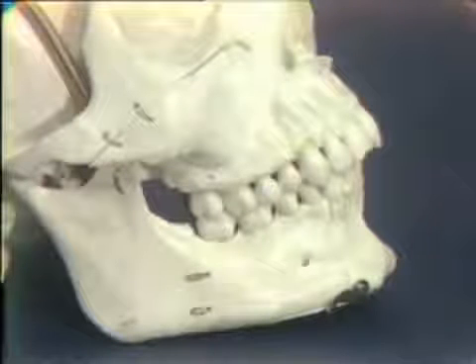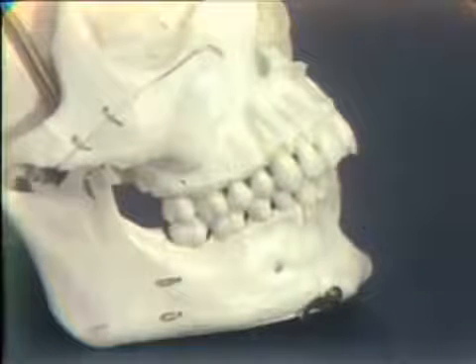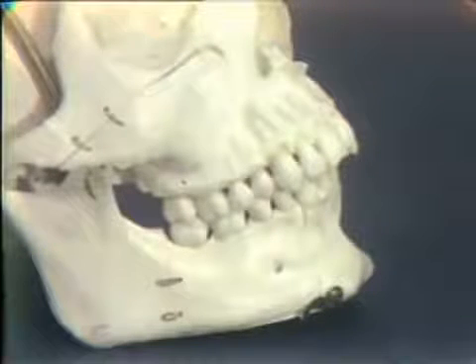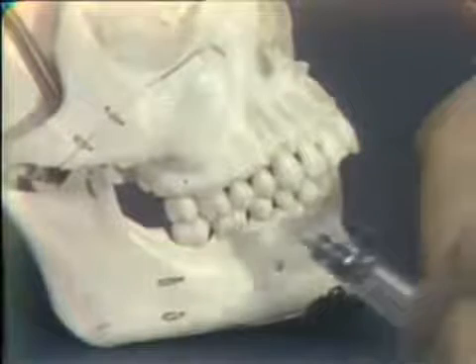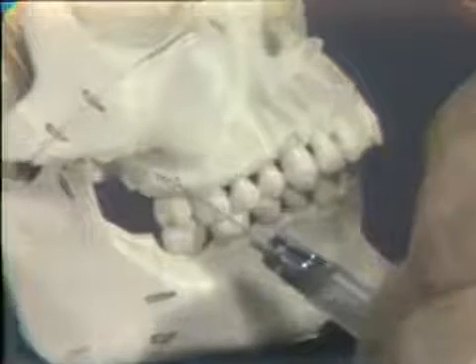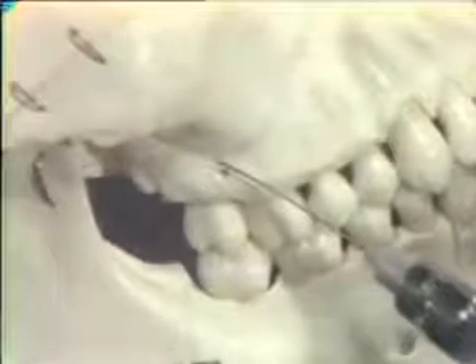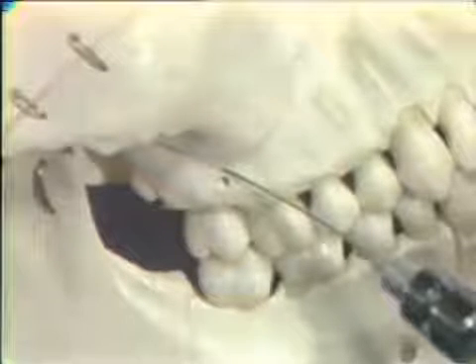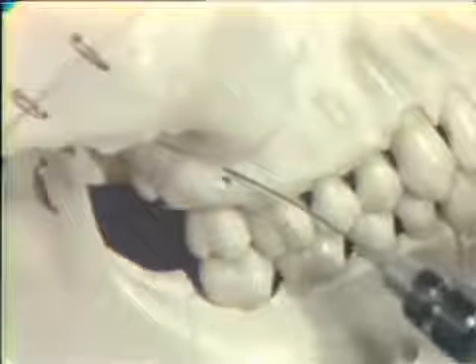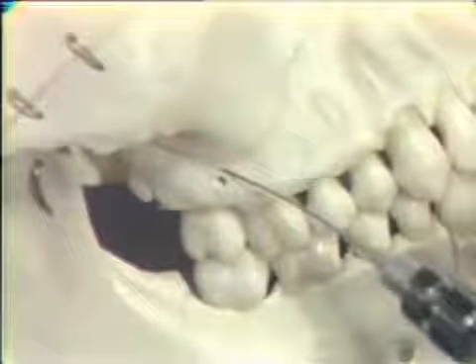With the mouth half closed, again, we retract the cheek to create tension in the vestibule, and the needle puncture is made out in the vestibule, and needle bevel then carried to bone. With at least the apex at a level of, or preferably slightly above, the apices of the roots of the first molar.